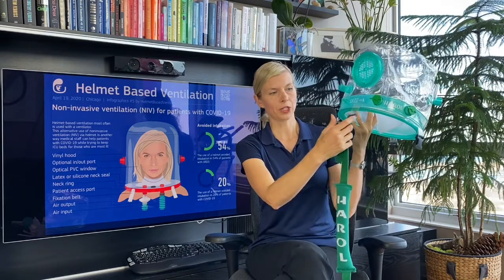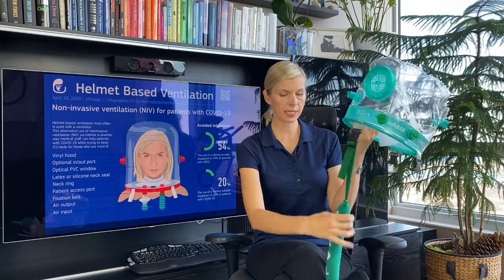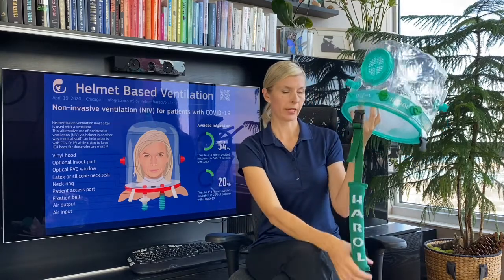Underarm straps are easy to adjust and easy to remove in case of emergency. They also have soft cushions to prevent any skin breakdown in the axillary area.